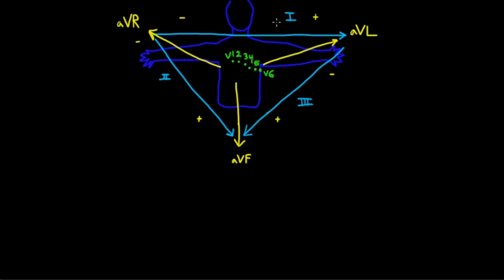So knowing all of our tools here in the EKG, it's important to know how myocardium can be directly sensed by certain EKG leads. And that's really what we're going to cover right now. We only focus our attention on a few large areas of myocardium. Here they are.